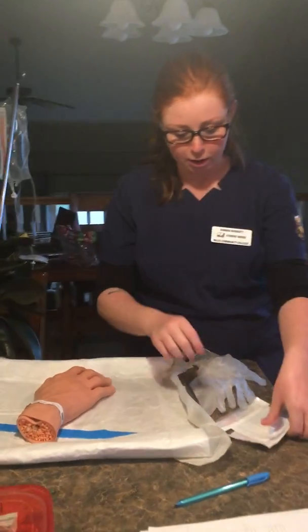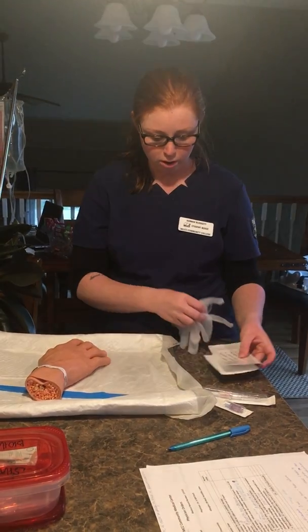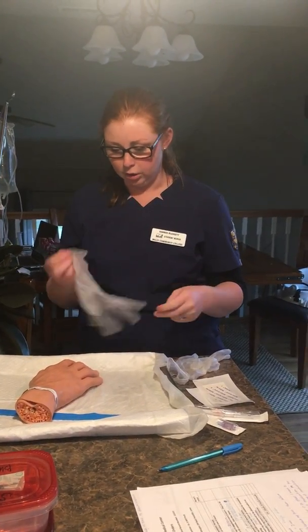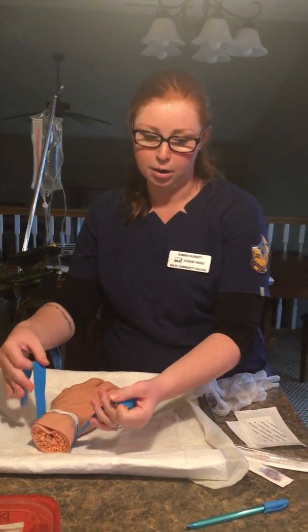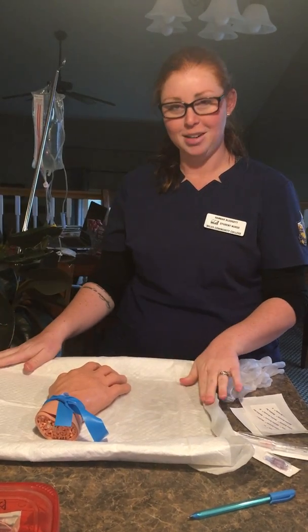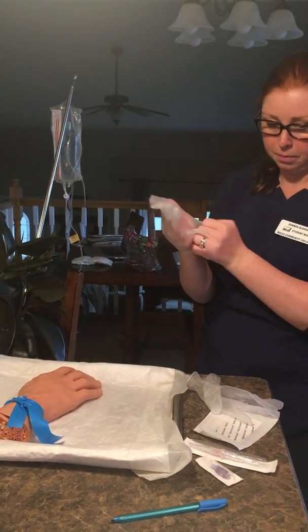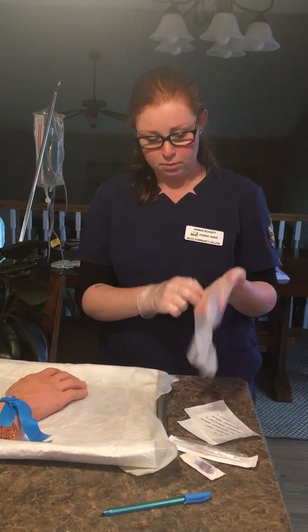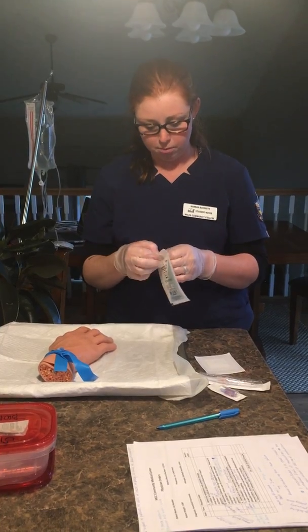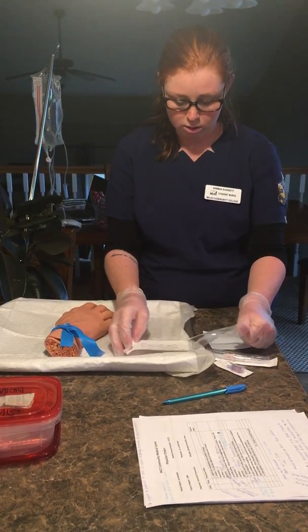Once I've found that, I can undo her tourniquet so she's comfortable and go gather some supplies. I'm going to be using a 20-gauge IV catheter, a saline lock tip, and a few things for the dressing — gauze and IV Secur. Once I have all that together, I'll wash my hands to maintain a clean, safe environment and place a pad underneath her to help save the linen.